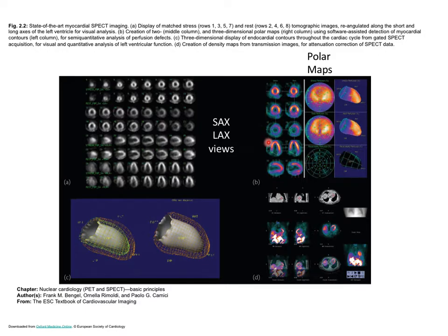And so you can see here there's a few short axis slices where for a large chunk, many degrees along here, the perfusion seems to be lower than the other side of the heart. So you have the other side of the heart to compare to. And in the long axis views, you can see down here, there's a chunk of tissue that seems to be missing signal. And so that would indicate that there's lower perfusion.